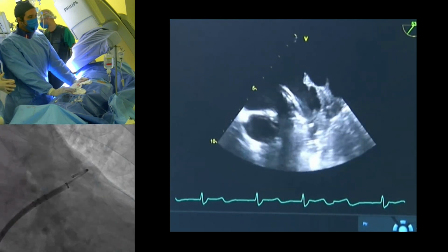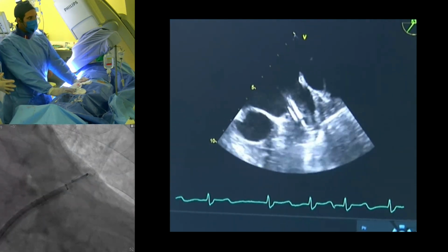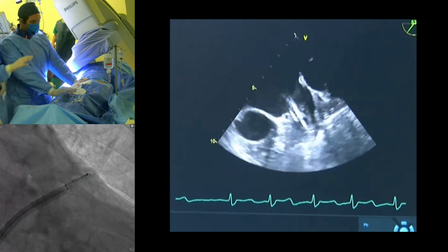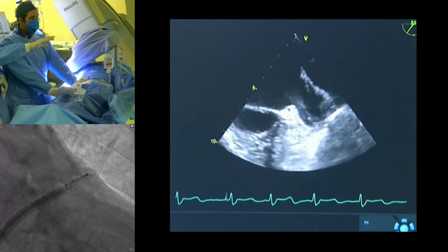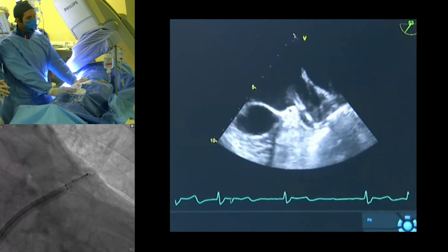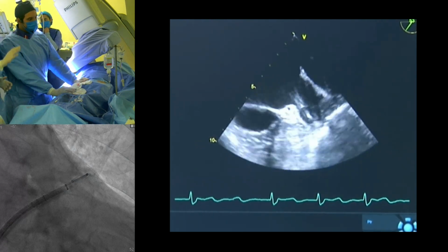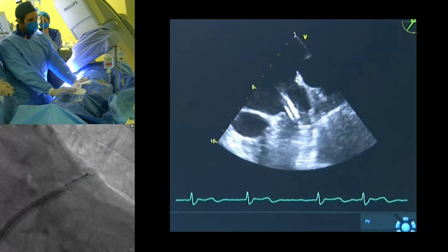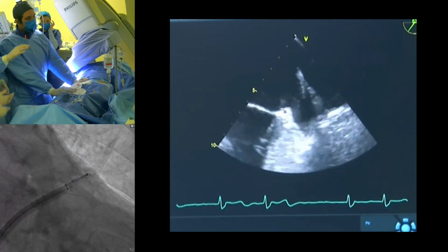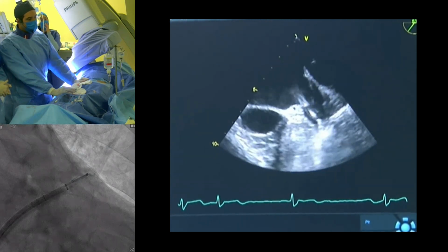We believe that we will have just enough compression, something like 15% like this, and have enough proximal coverage. We will not cover all the way to the anatomical ostium, but that's also not always what we want to obtain. We don't want to close all the way to the coumadin ridge. That's not really our goal all the time. Yes, and here there's no trabecularization, so it's a smooth part. So I think we can accept a slightly deeper implant.